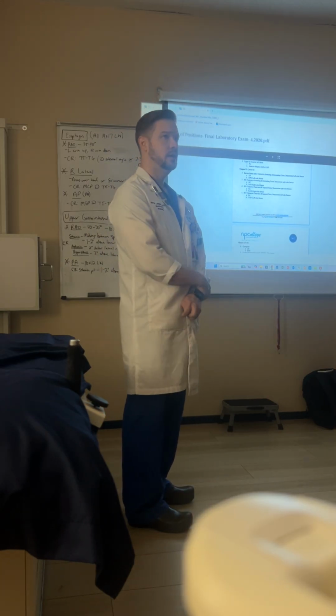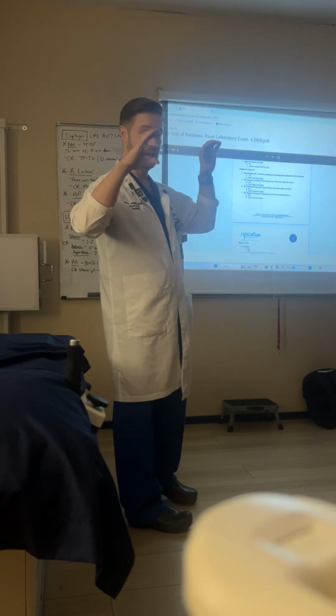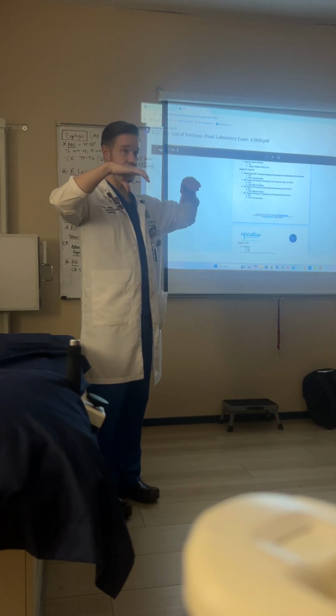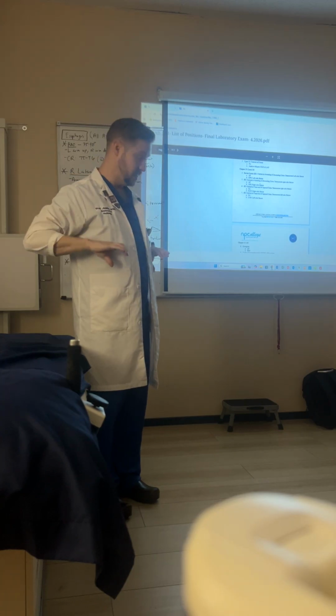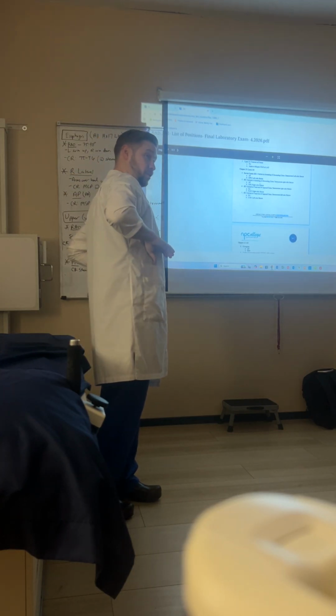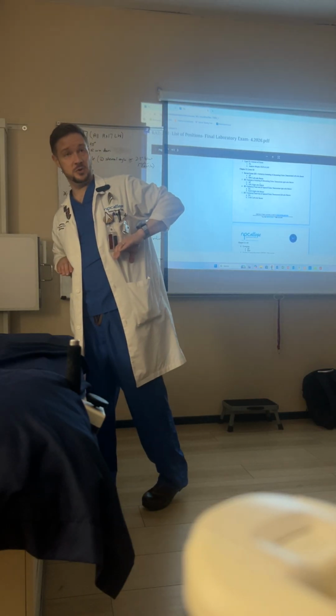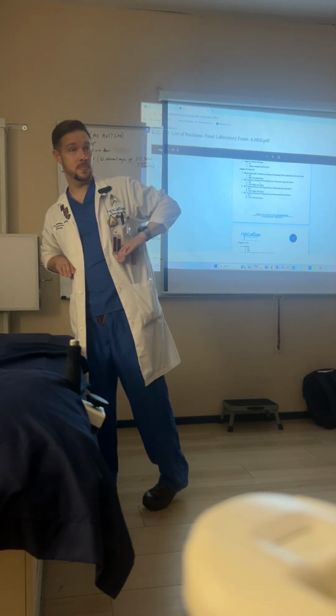How do I want to explain this? For demonstrating the flexures, I use my hands. Again, I always love to use my hands. I cut my hands like this. These represent the flexures. If I want to see the right colic flexure open, I do an LPO. If I want to see the left colic flexure open, I do an RPO. Okay?